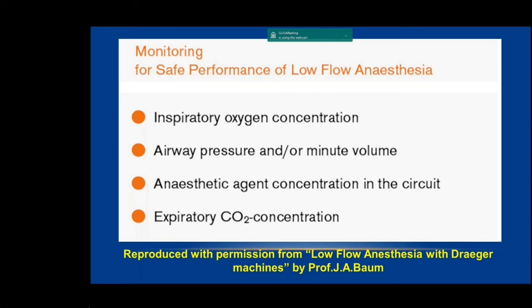You cannot do a case if you don't have this kind of infrastructure incorporated in the software of your machine, or you should have monitors.